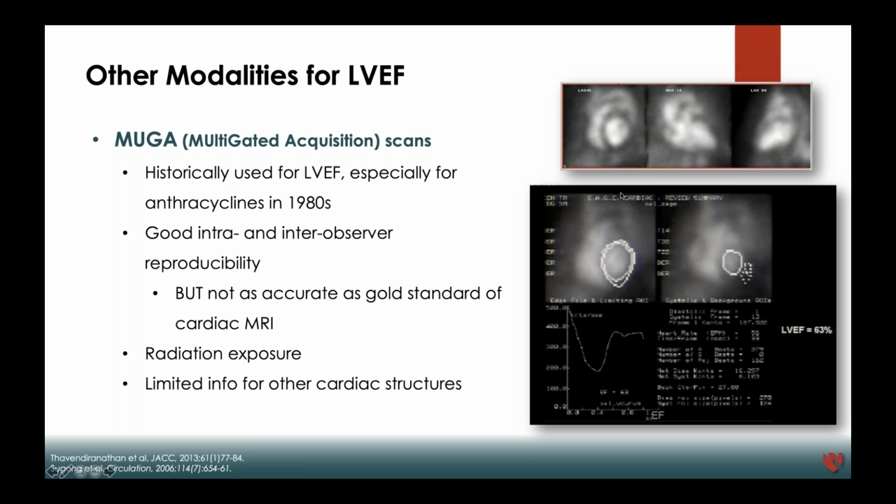The historical accuracy of LVEF by MUGA may be true when it's compared to an echo, but it's still very subjective. And if you leave it up to an automated program, then it's not going to factor in various technical issues. So I think it's surprising how often MUGA is still ordered.